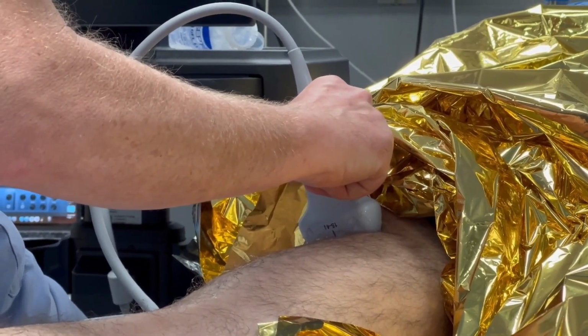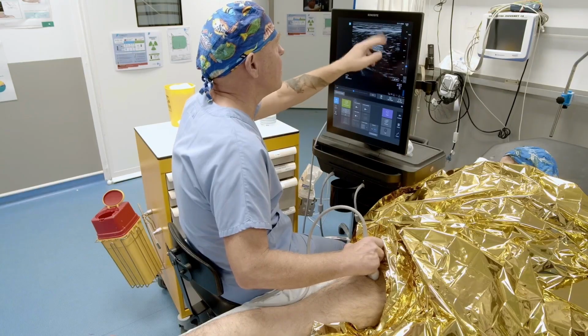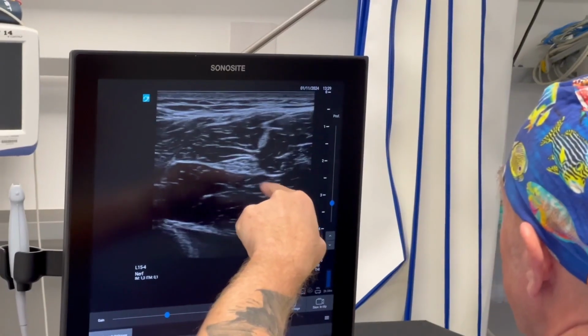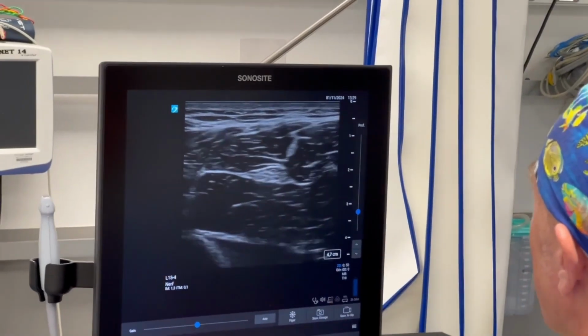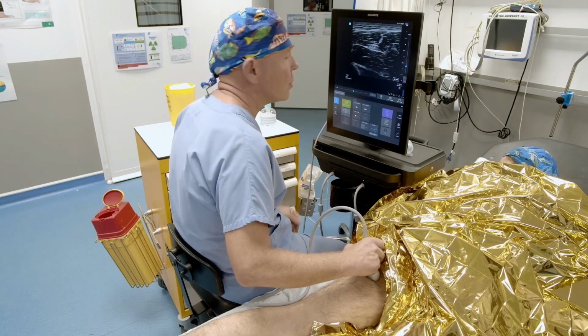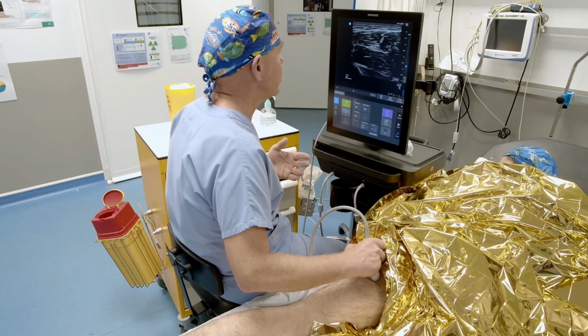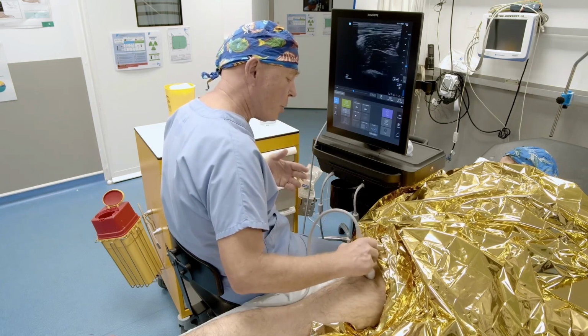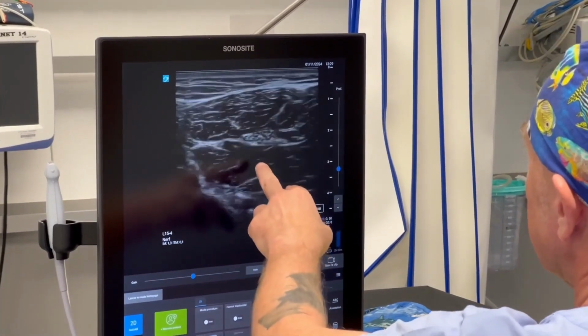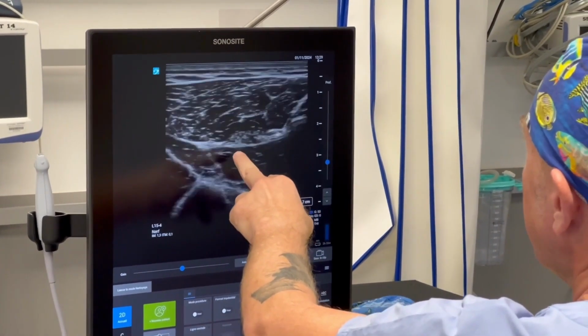Actually, at the subgluteal level, it's not that far. Here, Sam is particularly slim and thin, but generally, it's about 4 centimeters deep. So we have the characteristic image of the sonoanatomy element from step number 2. Just like we did with the nerves in the forearm, we can also do a workshop on this. And as you can see, we're following the nerve, right?